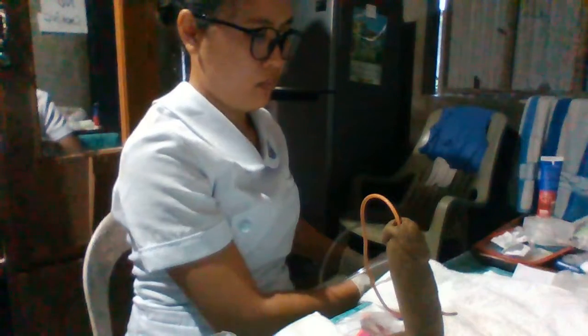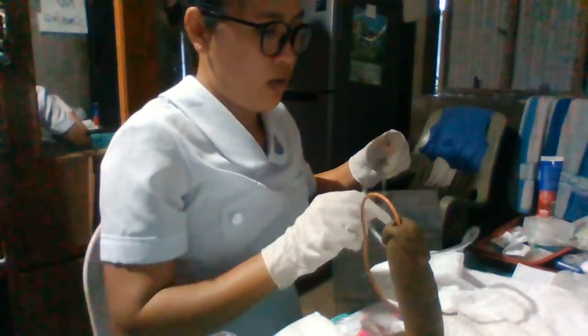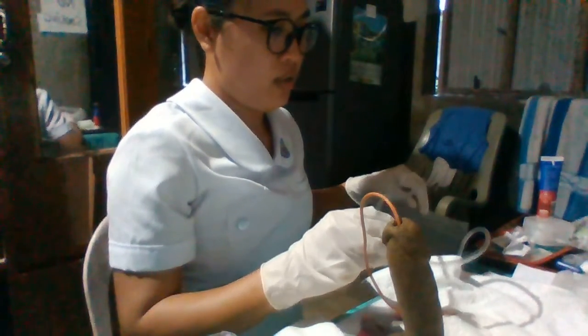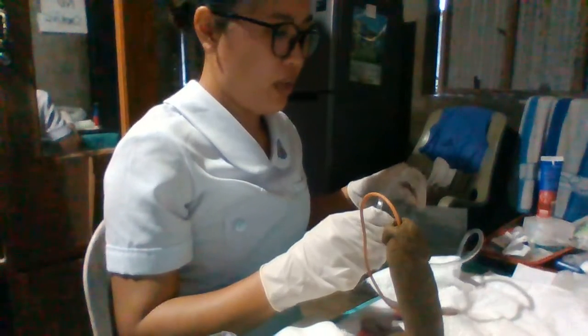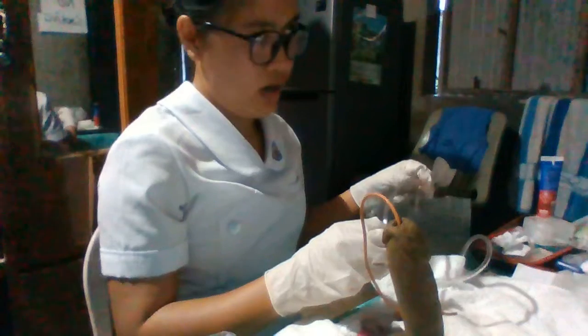Next, after checking, the collection bag is emptied as necessary, but at least every 8 hours.